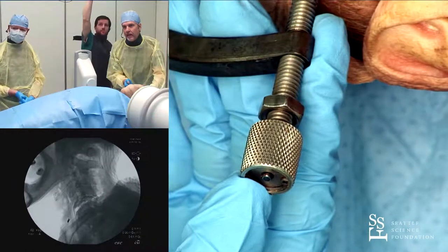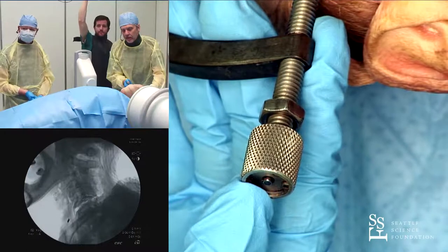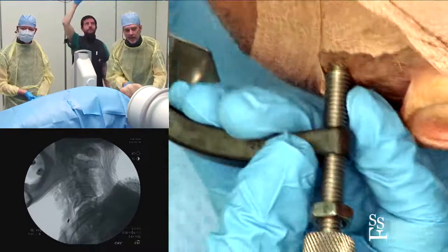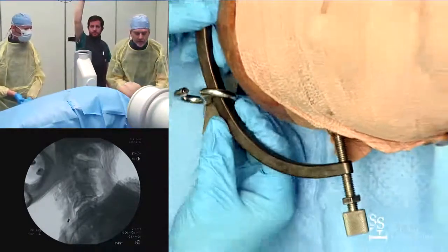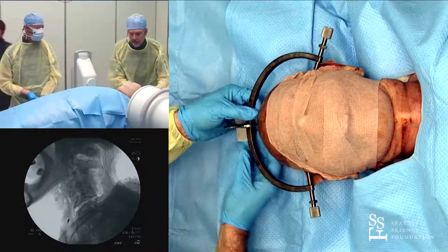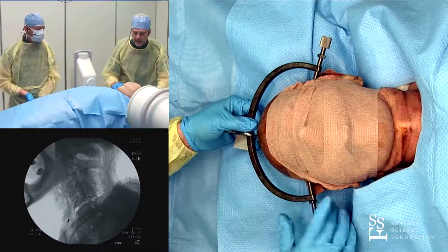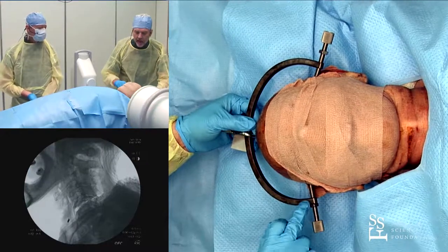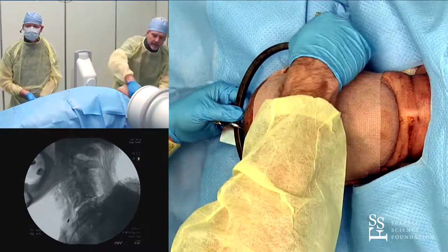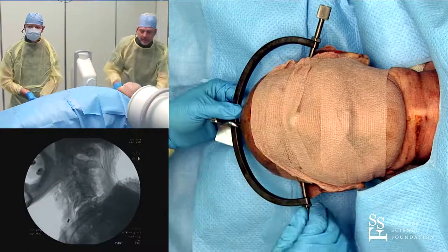See how that's popped out? You wouldn't turn the patient this way in practice, but that's what you're looking for — make sure that indicator pin is out. I'll put a little gentle traction on and make sure it feels solid. Now tighten down this locking nut to approximate the Gardner-Wells tongs and keep the pin in position so it can't back out. The tongs are in place and we're ready to add weight.